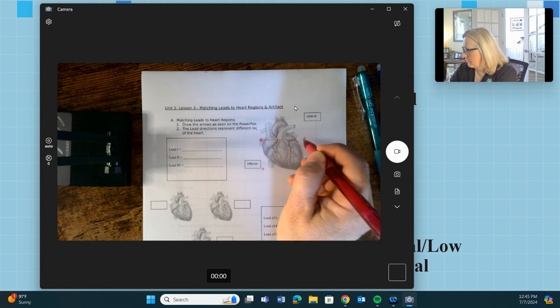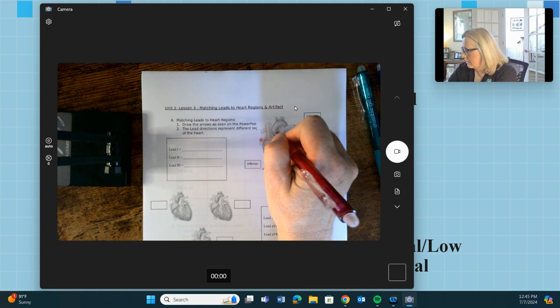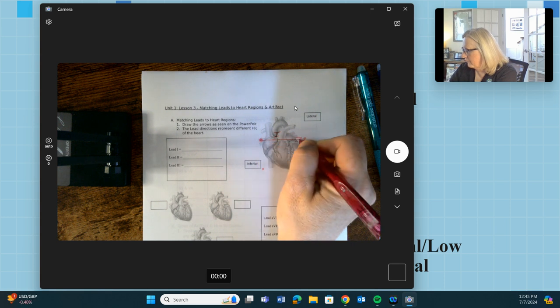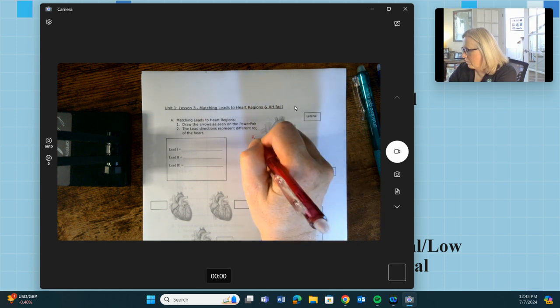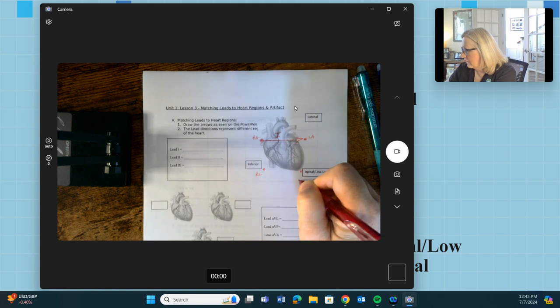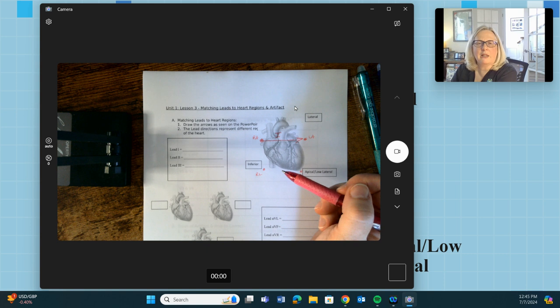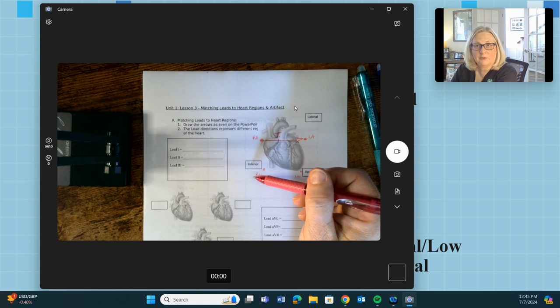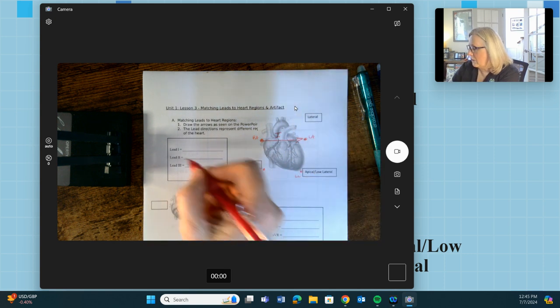So this goes from here to here, right? That is going to be lead 1. Draw this right on your paper. Lead 1 goes from the right arm to the left arm. Remember, this is the right arm. This is the left arm. This is the right leg and the left leg. As we did in the last class, you'll notice we don't really use the right leg because that is ground, correct? All right, so right arm to left arm is lead 1. And you can write that over here.